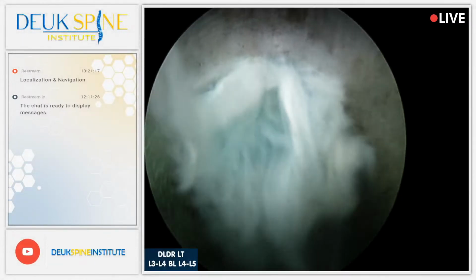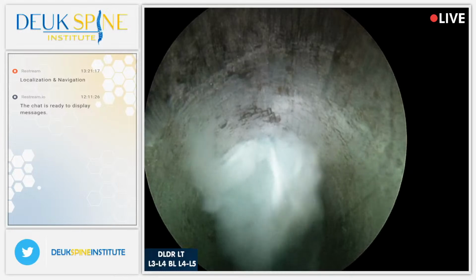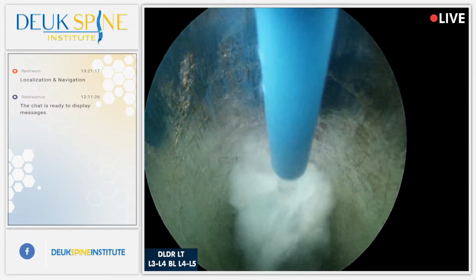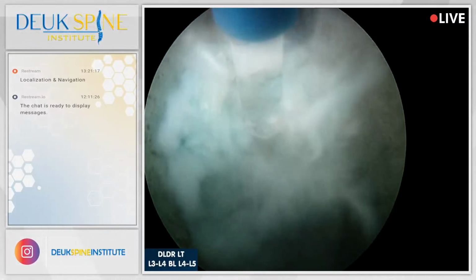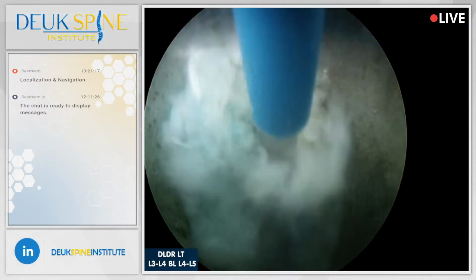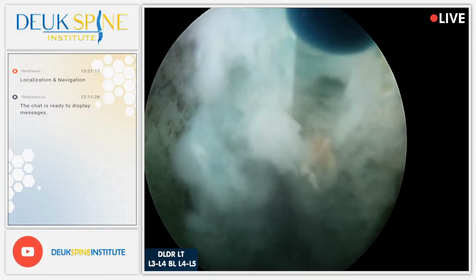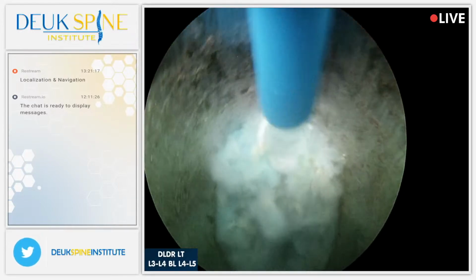Beautiful. I'm going to sharpen up the picture. There we go. We're looking at the annular tear. That's the little white strands. And I'm going to start removing, we call this a debridement, where we're cleaning out the tear, removing the herniation and all the scar tissue that we can. See the little orange crusts that are there? Those are calcium deposits within the tissue called dystrophic calcification. It's a sign of chronic inflammation and tissue damage. So this disease of herniated disc is damaged tissue in the annulus.